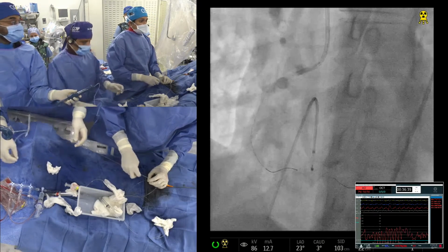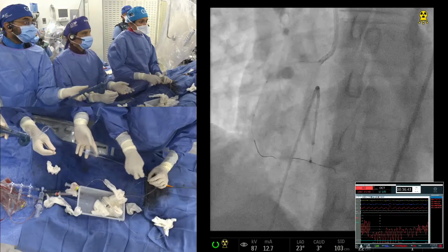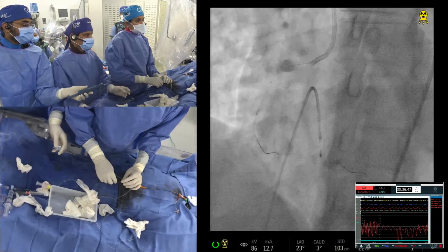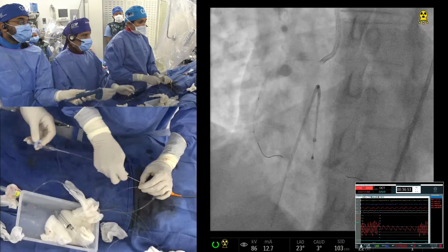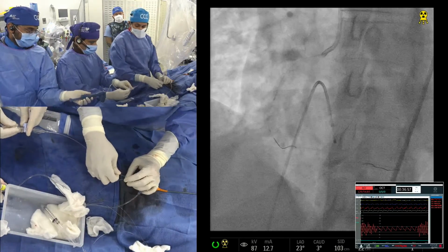In the meantime, replying to Dr. Gul Zaman Khan, who's asking about the plans for distal RCA. We discussed that towards the beginning, and we'll address that once we make progress. With this issue in the proximal, probably don't even think about messing around distal. Yeah, exactly. Exactly right.